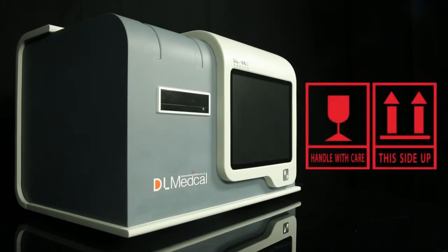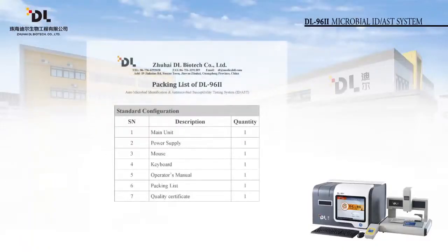The user first opens the packing. Please follow the sign upward to take out the instrument. To avoid damaging the instrument, please don't knock and pry. Place the instrument on a flat and stable table close to a power source. Please follow the product list to inspect the instrument and fittings. If anything is omitted, please contact the supplier immediately.